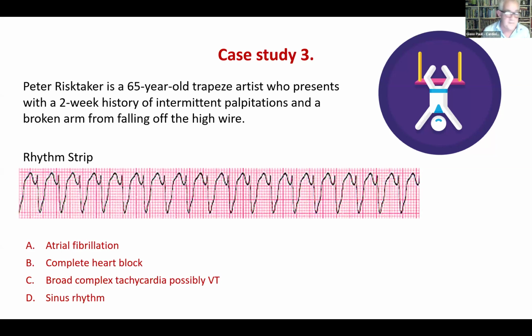It can be a sign of left ventricular hypertrophy or atrial hypertrophy, which is much easier to look at with multiple leads, because one lead only gives one view. It's like, you can tell what type of car it is if you're likening it to a car, but you can't really tell about all the features of it. So in order to look at the features of someone's heart, a more comprehensive view, that's where the 12-lead ECG is essential, because nothing can hide. Well, try not to hide anyway. But it's much more useful to have a 12-lead ECG.